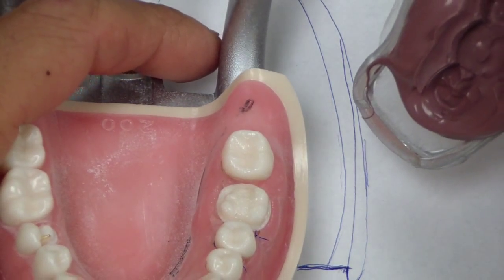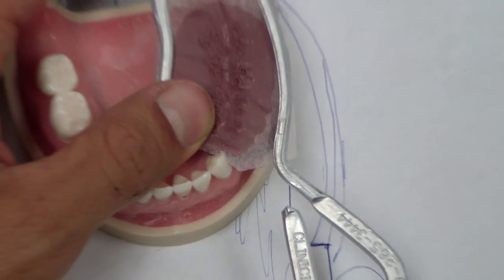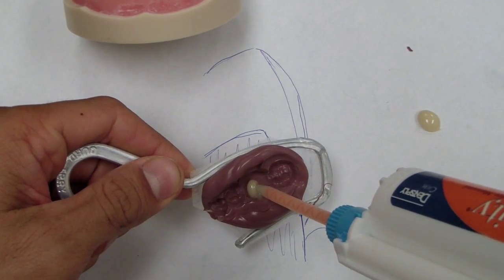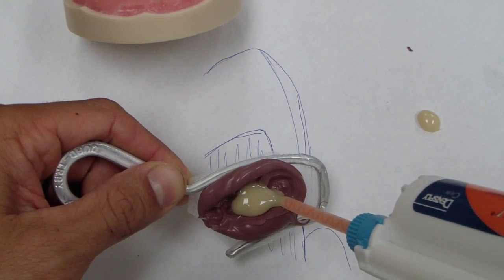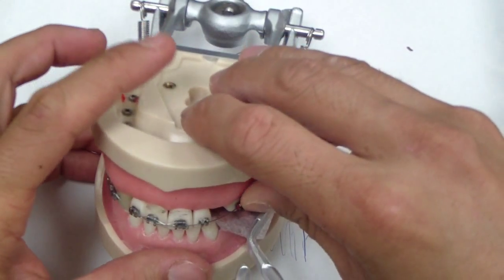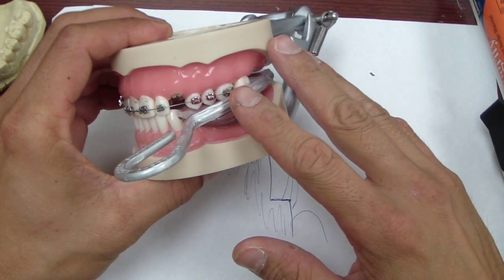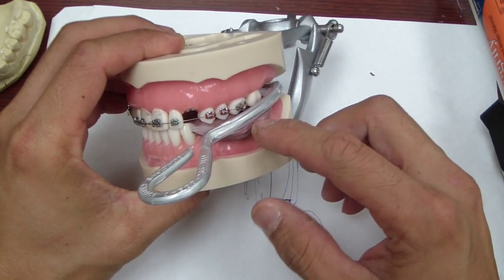I'm going to try this in first just to make sure I know where it's seating — it's seating right at the canine, and of course the patient is not occluding or biting on it. Let's get going here: extrude a little bit of material, place it right into the bottom, try to eliminate as many bubbles as possible, and then seat it intraorally. Depending on what type of stent you're using you may have the patient bite down. We're using a rigid frame for the dual arch impression to prevent flexing; probably the best option would be some sort of vacuum-formed matrix that prevents any flexing, since the polyvinyl siloxane in this case still flexes.